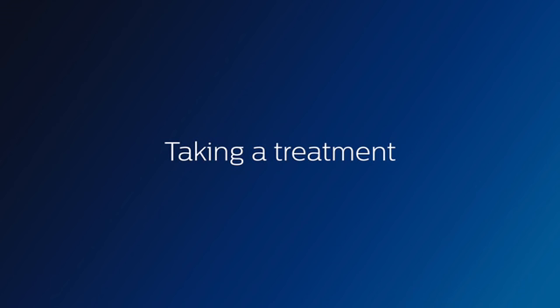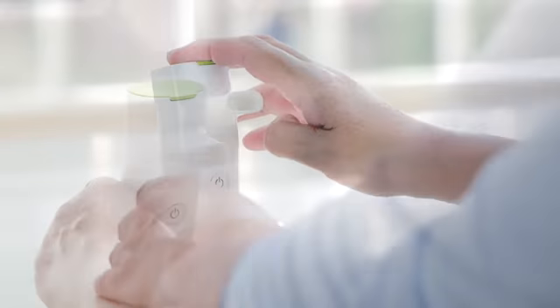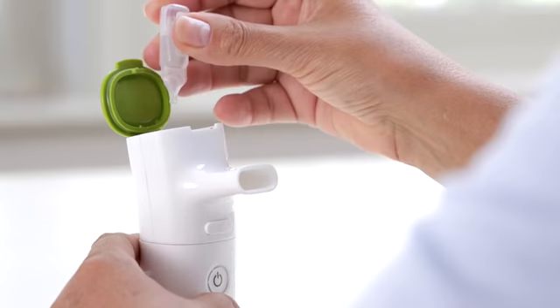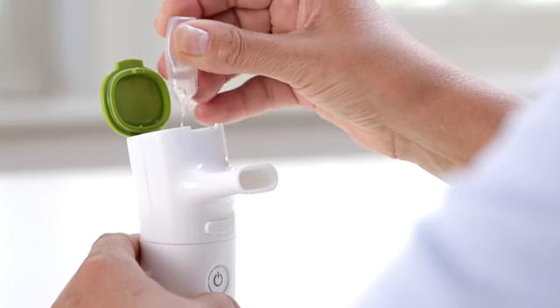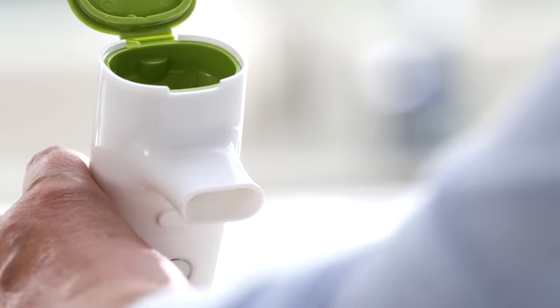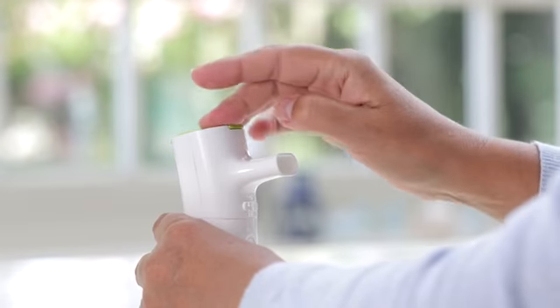Taking a treatment. Attach the mouthpiece to the handset. Then lift the lid of the green medication chamber and empty the contents of your medication vial into the chamber. Make sure you don't exceed the maximum fill volume, which is marked by the word MAX under the hinge. Close the lid.